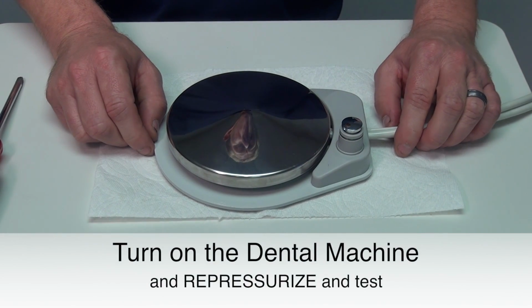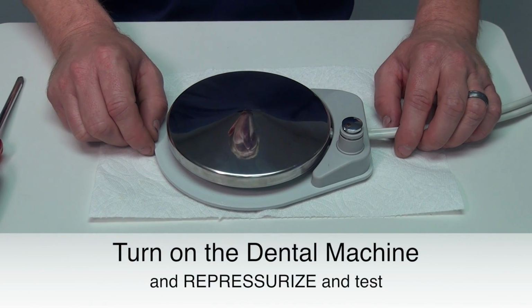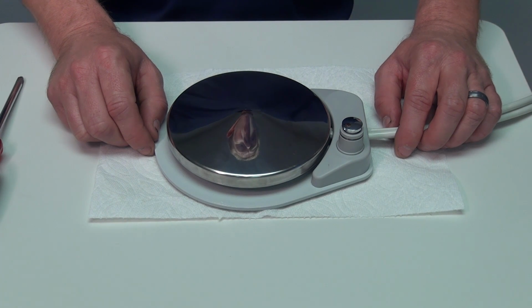Turn on the dental machine, let it repressurize. Test the foot control. If there is any problems, please call DentalAire for further assistance.